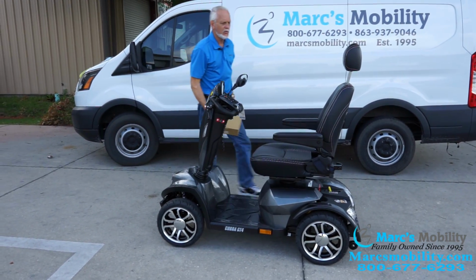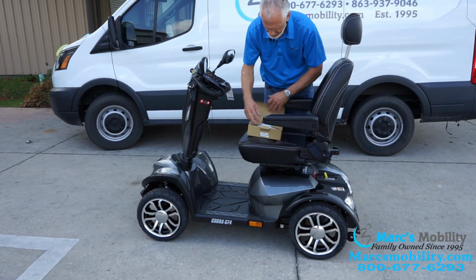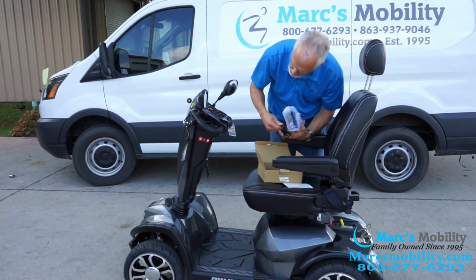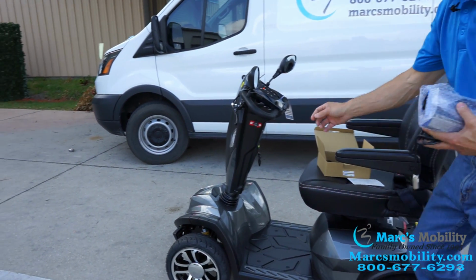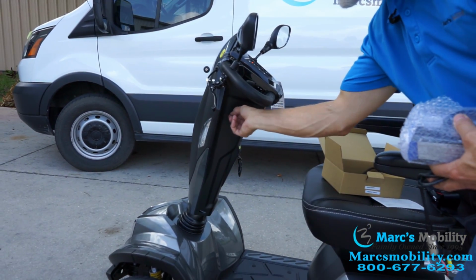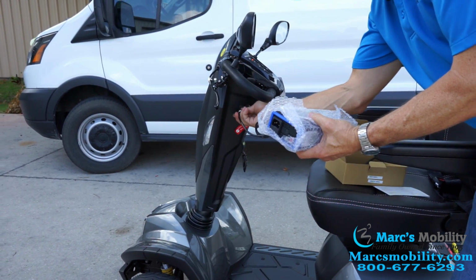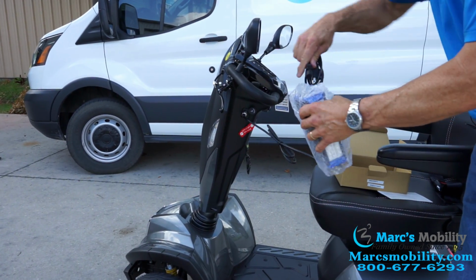This is a brand new scooter here, so I'm gonna take the charger out of the box. So you take your charger and you would plug it right here. Since it's a new scooter, it still has a little piece of tape over the entrance for the port. So you would plug it right here and plug your other half into the wall.